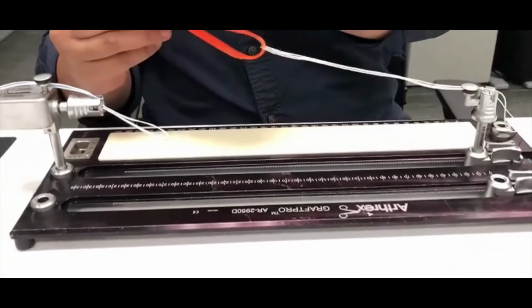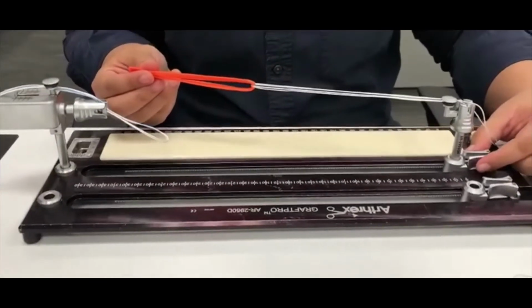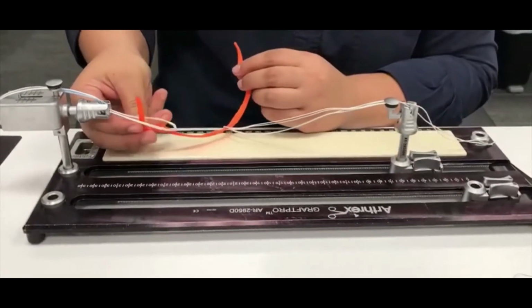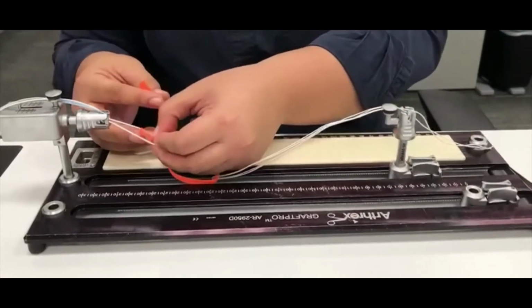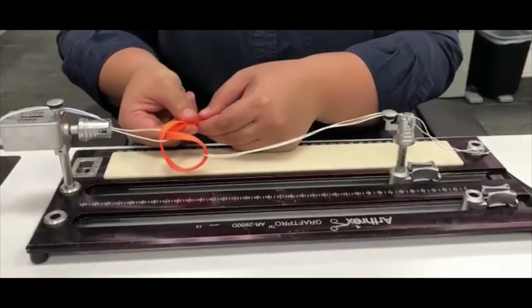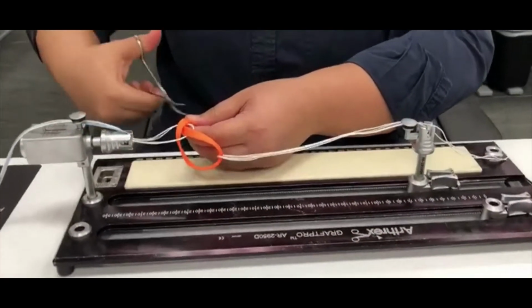Load it halfway, and then we load to the femur side. You can bring this closer, press and push. One strand will go from bottom up into the femur loop. The other strand will go top to bottom of the femur loop. Bring them together. Take an artery or an Allis, just clamp at the edge, just to hold it like that.